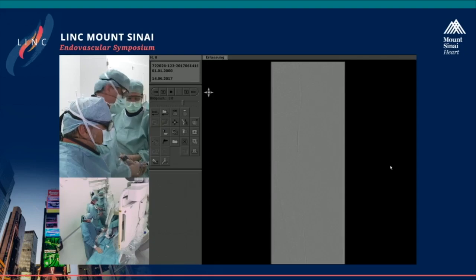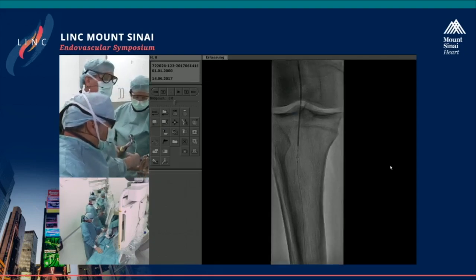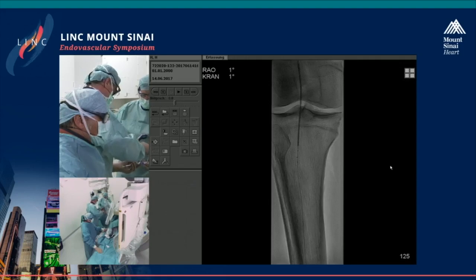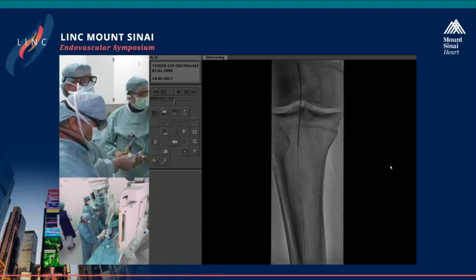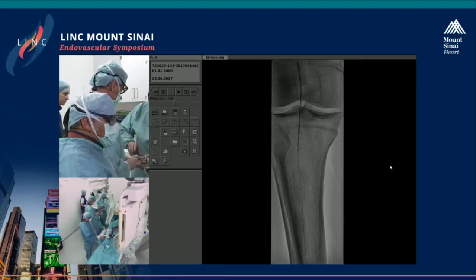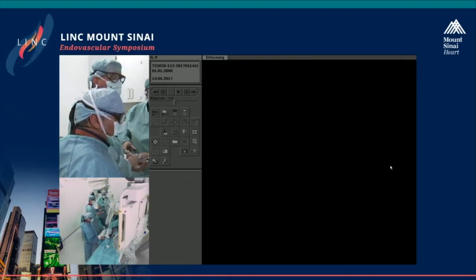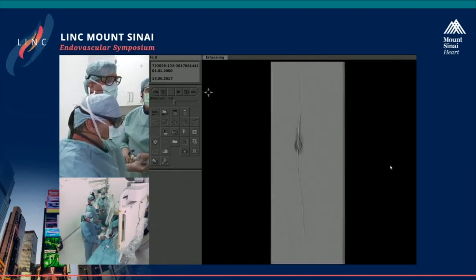That was maybe not enough. Can you take the pressure down once again? Yeah, not enough contrast here in the solution. Let me change once again, sorry. Let's take it a little higher. Yeah, let's do it here once again, please. Okay, this is again a successful one.